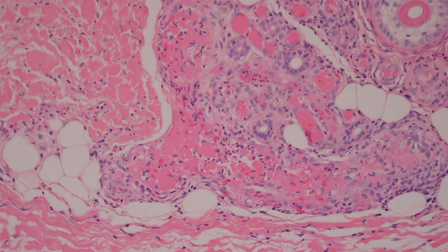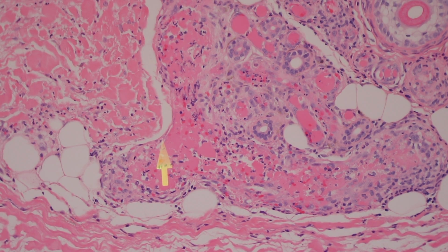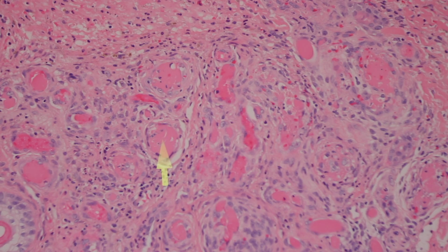You'll see fibrin stains in the background between these deposits sometimes, but the deposits themselves will light up either with IgM or IgG, depending on whether you have type 2 or 3 or what type of deposits you have, what kind of cryos you have. So I think this is a really nice example. And this other piece, let's look at the other piece over here. Where did it go?